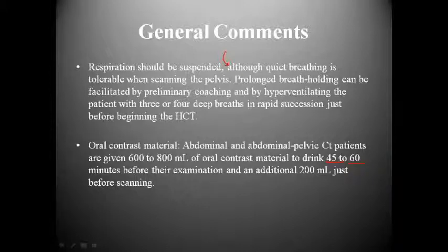Usually, what I have found to be the best protocol for allowing it to reach the rectum is the way our facility staggers the drinks.